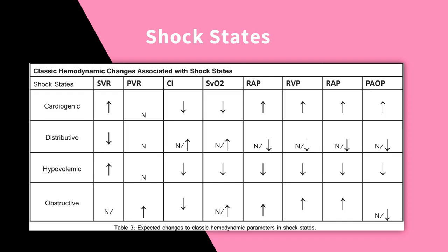This is a typical picture you will get from a textbook showing the four different shock states. However, many people try to memorize this during medical school. I don't want you to remember it in this fashion. I want you to think of it in more of a physiologic parameters.